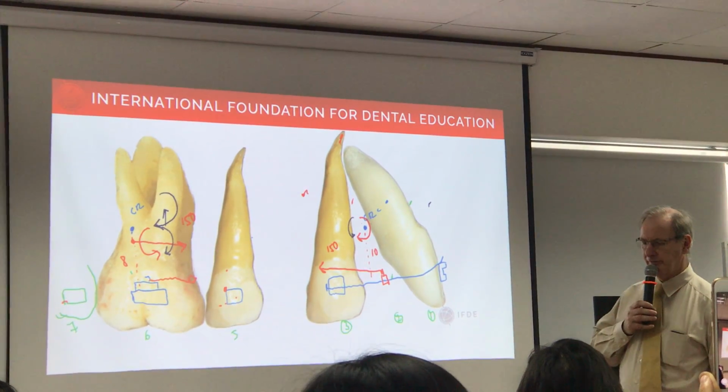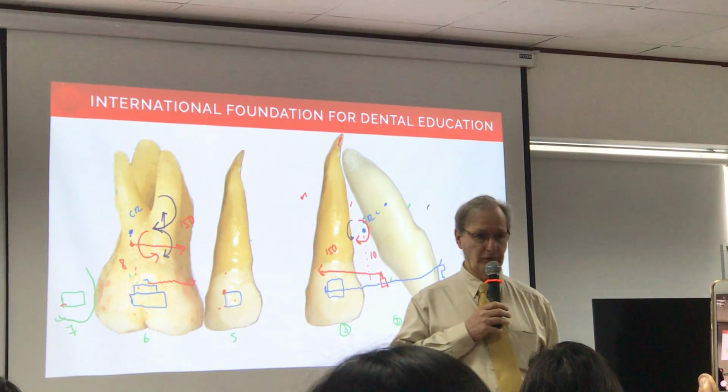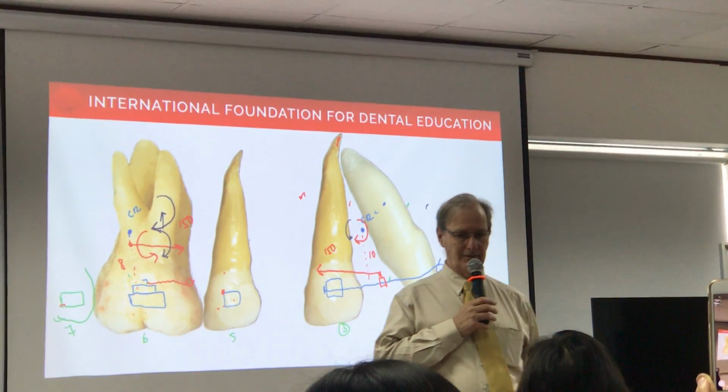I made a small error. If you want to have anchorage control with a headgear, and you can convince the kid instead of a microimplant, 12 hours, 14 hours a day is enough.